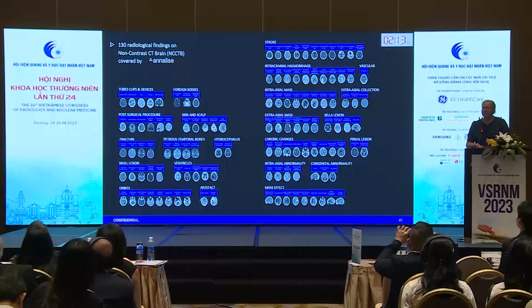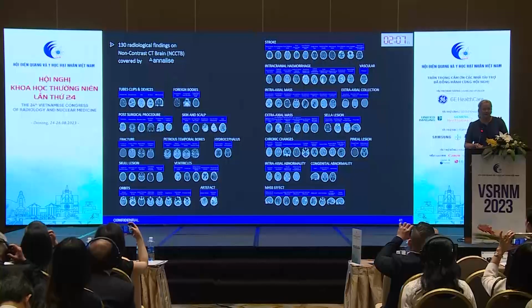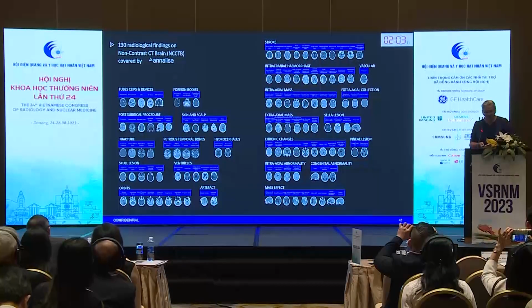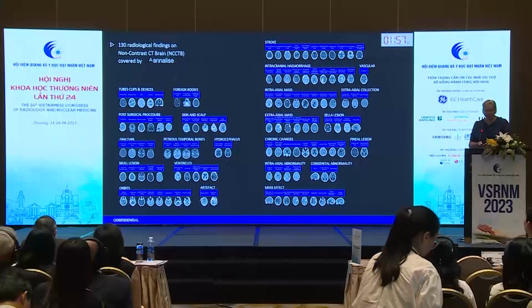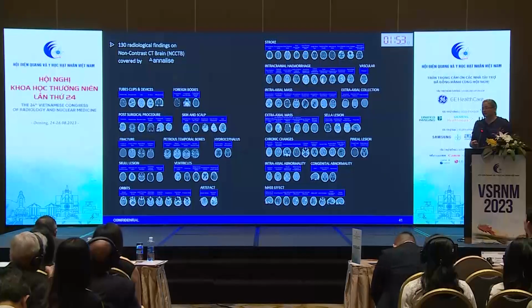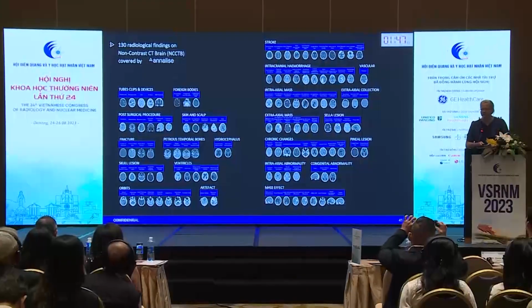So we then said, well, seeing as chest X-ray went so well, let's try it now with CT brain. And this is a very new thing. It's been only about 6 months. So we're using, again, an Annalise model, very comprehensive, 130 findings. And importantly, it covers the trauma. It covers the infarct, the stroke. It covers the bony changes. It covers loads and loads of things.